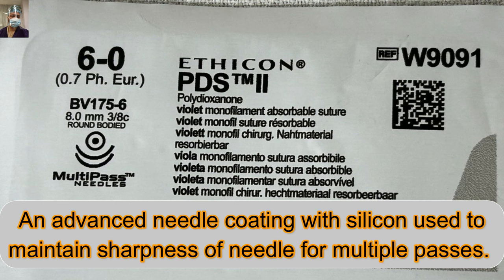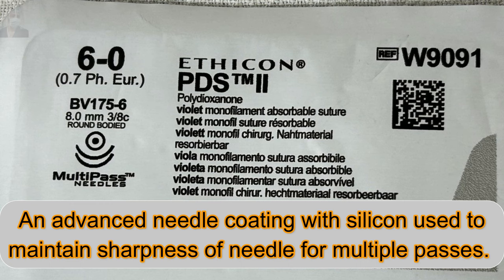Like this 6-zero needle — a very fine needle — it is a three-eighths circle with a smaller circle. The length is 8 mm and it is a round body. You can see there is a circle with a dot inside — it is a round body and the tip is blunt. This is just for demonstration: the smaller the needle, basically the finer the suture material will be. Here we are using 6-zero.